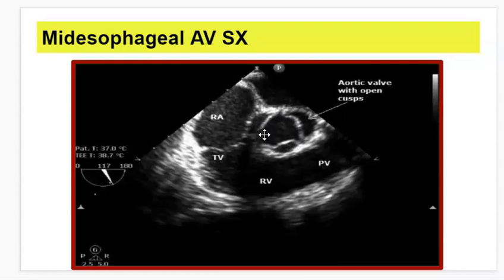The non-coronary cusp, even on transesophageal echo, is always with the septum between the RA and LA. So it has no coronary artery attached to that cusp. Left over here and right over here. This is the right ventricular outflow tract, and this is the pulmonic valve. So that's how you know where your cusps are. We'll talk more about that, but that'll be on the test.